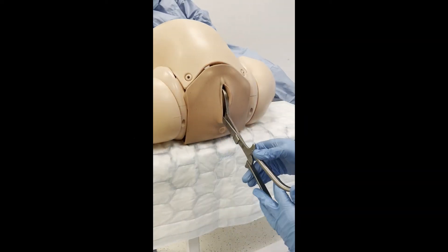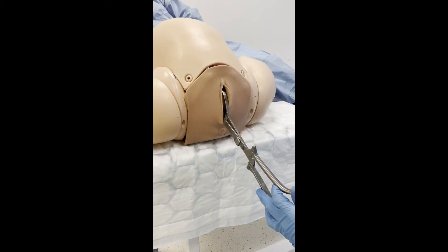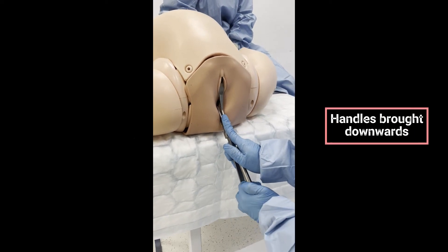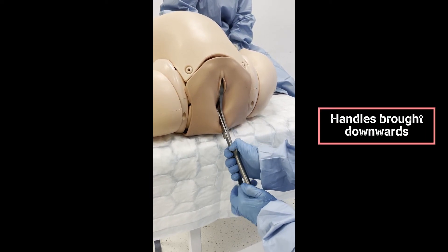In order to create space to rotate the foetus, the head is disimpacted. This is done by bringing the handles of the forceps downwards towards the operating table, then the operator pushes upwards gently to displace the head. The foetal head should now be one centimetre higher than its initial station.